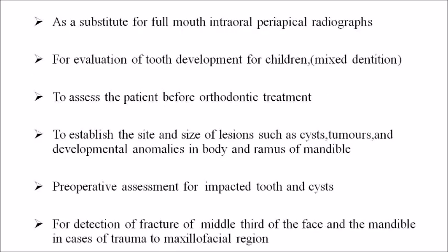The indications of the panoramic radiograph include: use as a substitute for full-mouth intraoral periapical radiographs, evaluation of tooth development in children and mixed dentition, assessment before orthodontic treatment, detecting tumors and developmental anomalies in the body and ramus of the mandible, preoperative assessment for impacted teeth, teeth associated with cystic lesions, and detection of fractures of the middle third of the face and mandible in cases of trauma to the maxillofacial region.